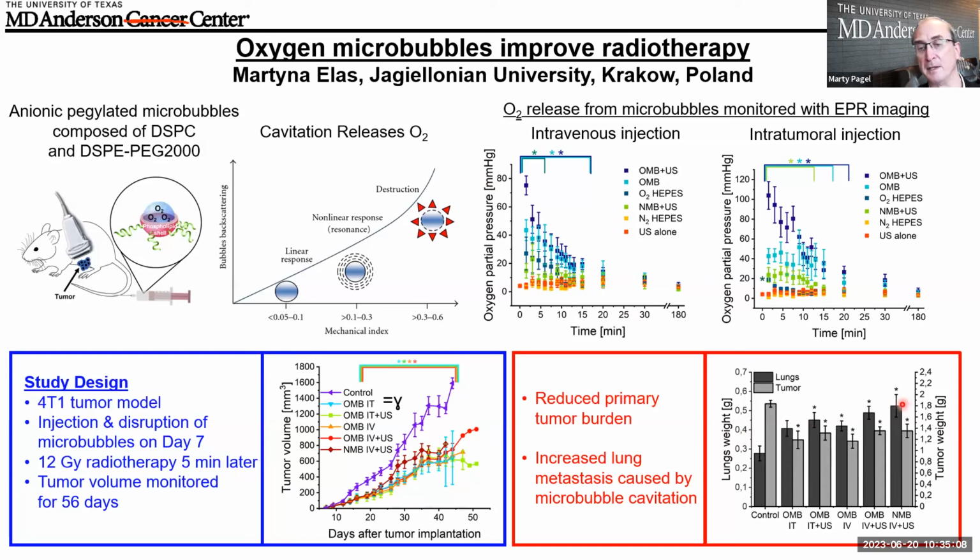This is not related to the EPR imaging at all. But there is certainly tumor weight a little better controlled with this therapy relative to control. So a great example of using EPR imaging to monitor the early response of O2 release in order to identify whether there's going to be a longer term outcome from this treatment.